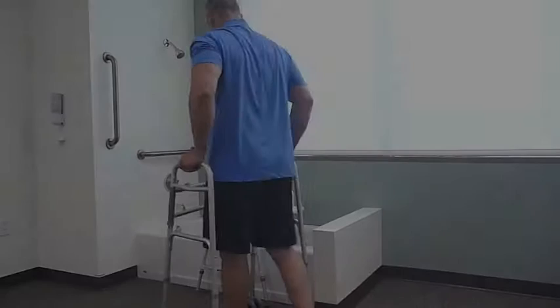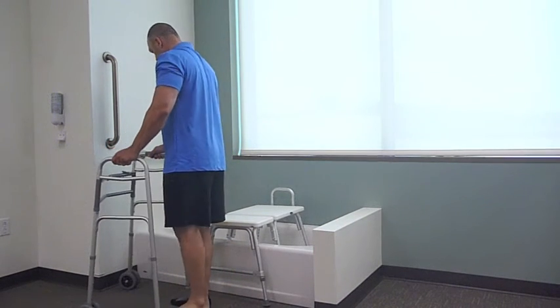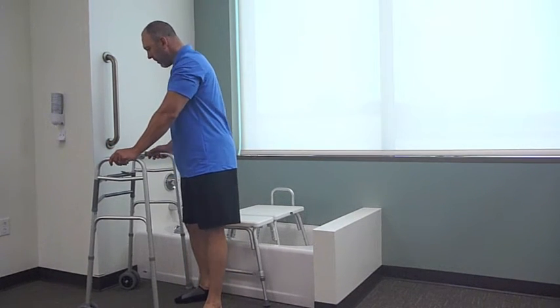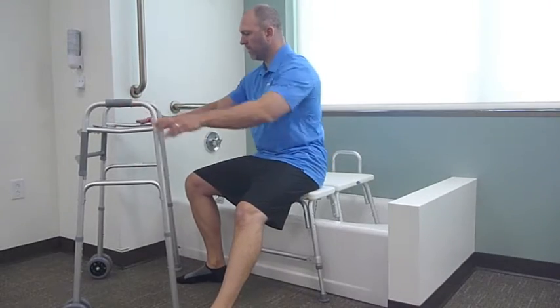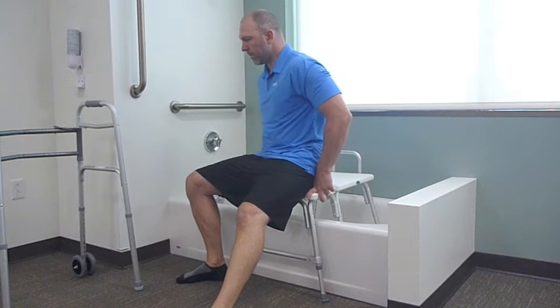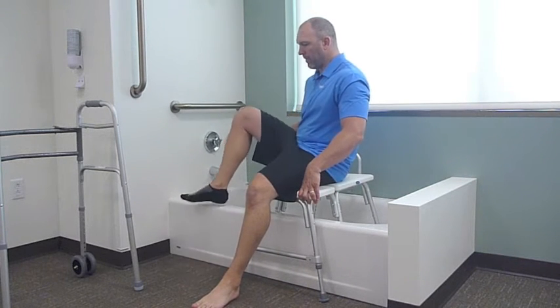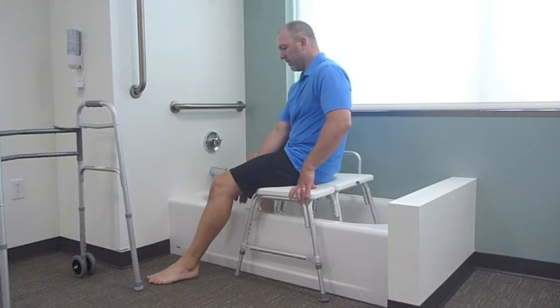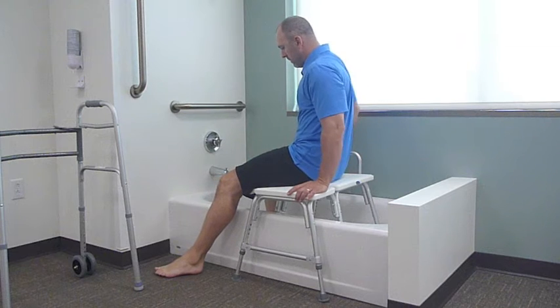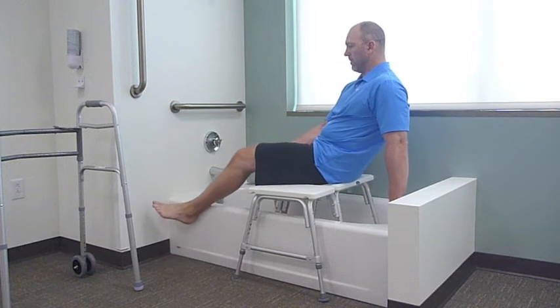Bathing with a long-handled sponge. Approach the tub and sit on the tub bench with good form. Scoot towards the center of the bench and place the uninjured leg in the tub first, and then using caution, lean backwards, supporting yourself with the arm to help lift the injured leg into the tub.